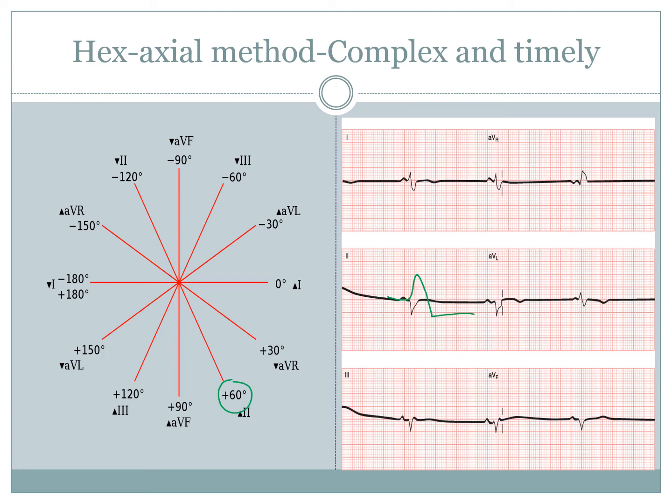Now normal axis is generally from 0 to positive 90, which we'll talk about in a little bit. Sometimes negative 30 does get included in there, and then you get the actual degrees of the deviation from there. As you can see, it's quite a difficult, complex method, and you really need the diagram in front of you.